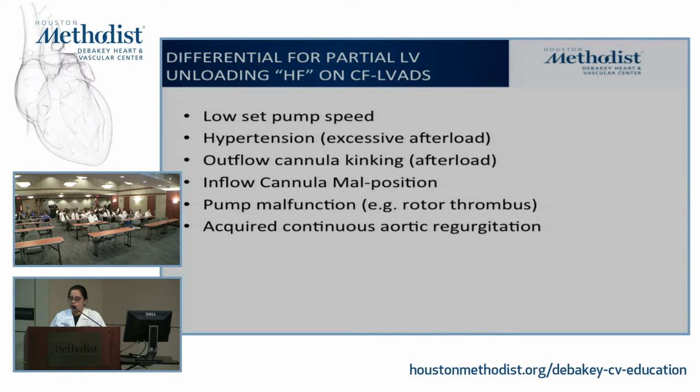But in my first, the ramp-up study, that showed that if you had better hemodynamics, not necessarily echo shapes and stuff, your overall outcomes, even adverse outcomes like strokes, your pump thrombosis rate, your hospital readmission rate, all of it was better.